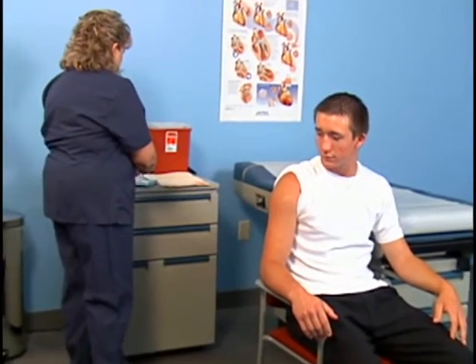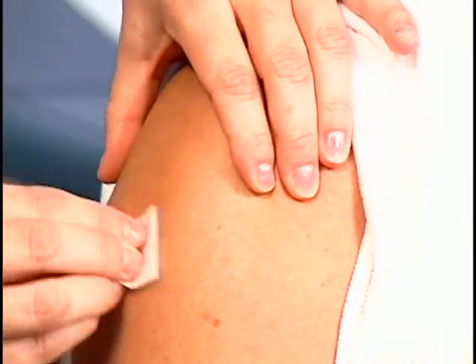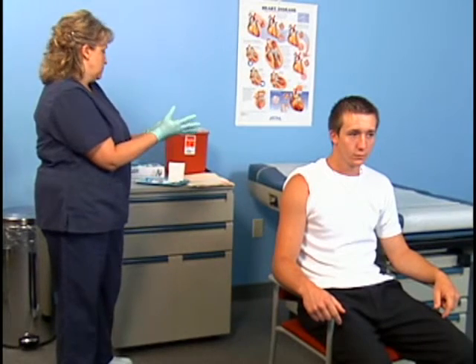Prepare the injection site. Cleanse the area with an antiseptic wipe. Use a circular motion starting at the injection site and moving outward. Do not touch the site after cleansing it. Allow the area to dry completely. If you don't, the antiseptic may enter the tissue when the skin is pierced, resulting in irritation and discomfort for the patient. Apply gloves and remove the needle guard.